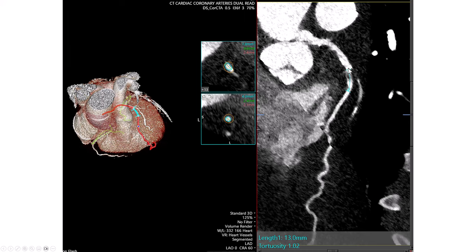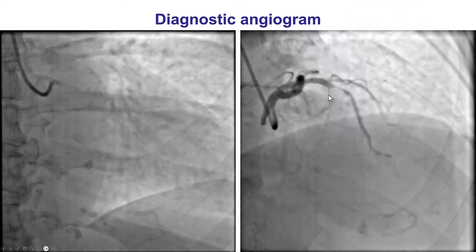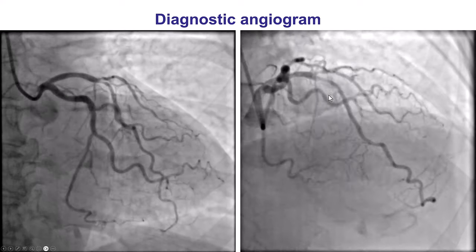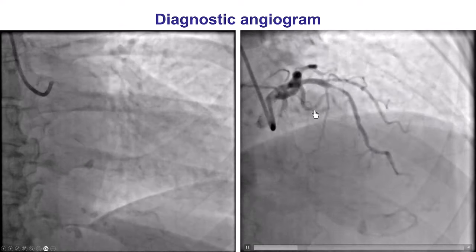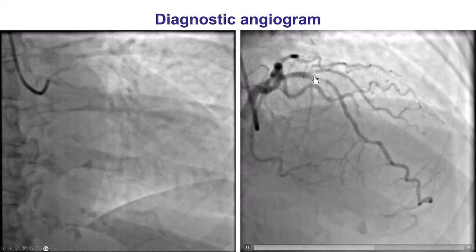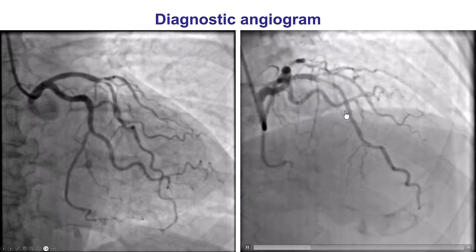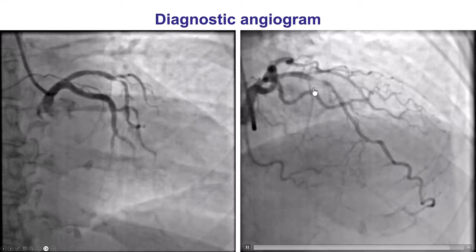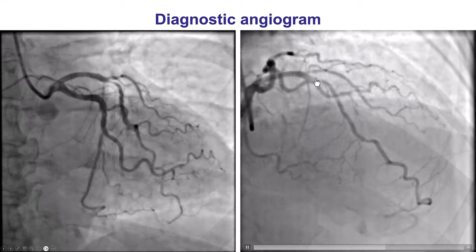The CT can also be used for measuring lesion length, which measures about 13 millimeters, with a lumen of 2.1 mm distally and 2.4 mm more proximally — although the lumen can sometimes underestimate vessel size on coronary CT. On the coronary angiogram, sure enough, there is a significant lesion in the mid-LAD after the takeoff of the diagonal branch, with no other significant lesion in the remaining LAD.